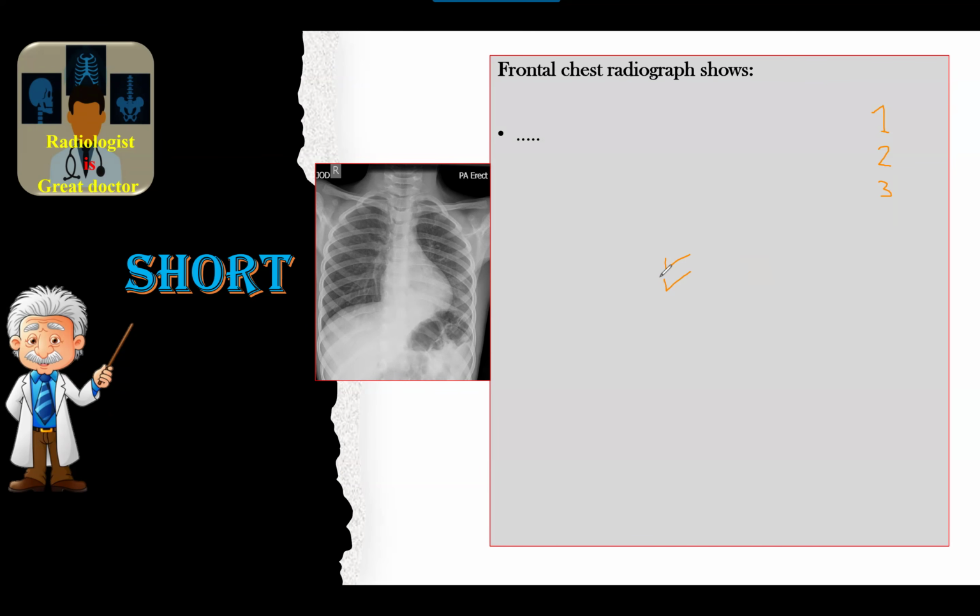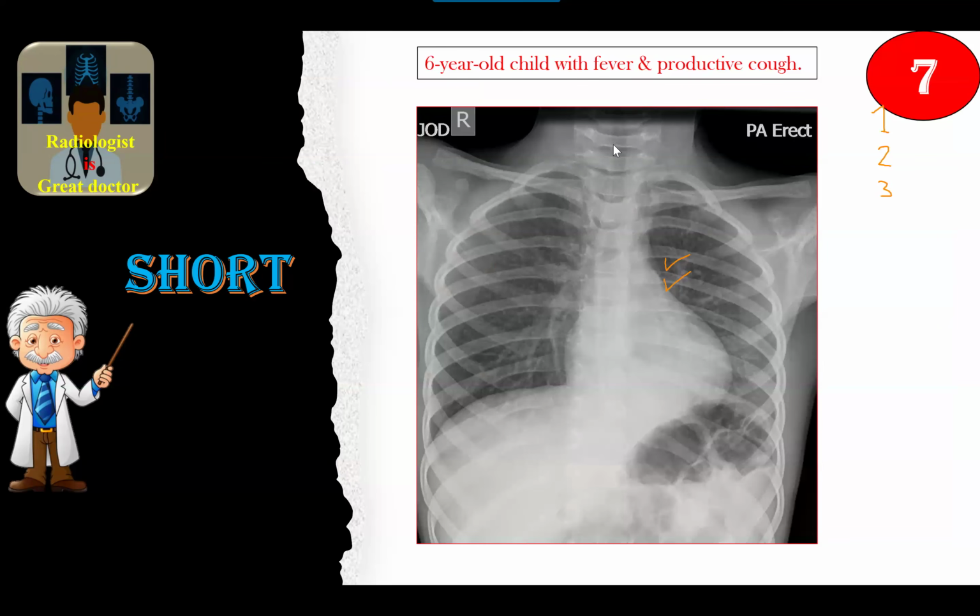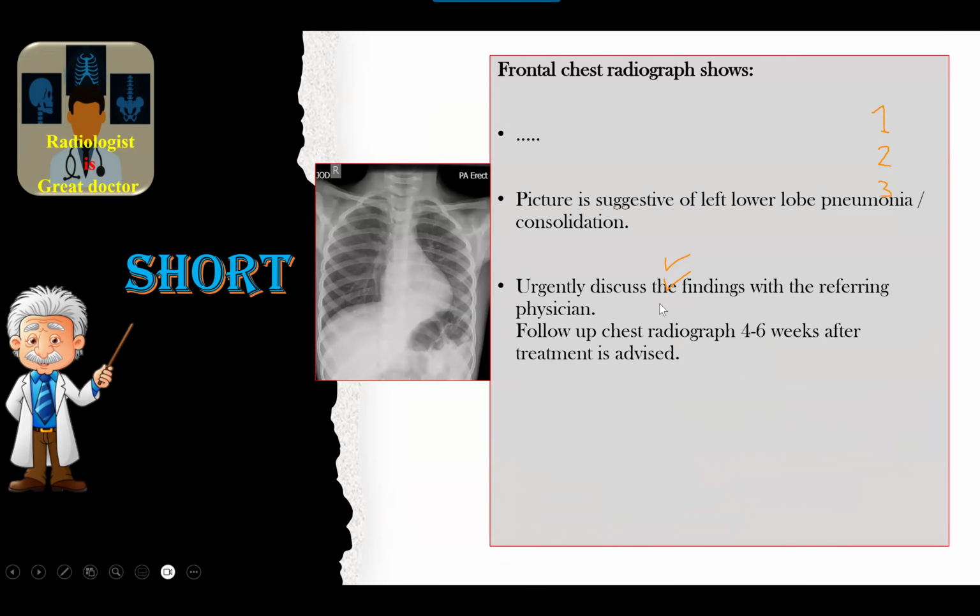You lost a lot of marks. CT scan, I didn't say that. Now it's not an oral case. Remember, fever and cough, it's infection. I didn't say repeated episodes of fever and cough. You know the difference? Repeated episodes mean sequestration or chronically retained foreign body, for CT scan. This is for the oral. But now fever and cough, it's a very simple common case.